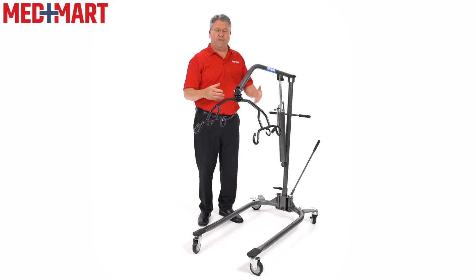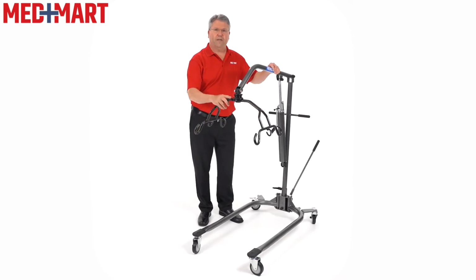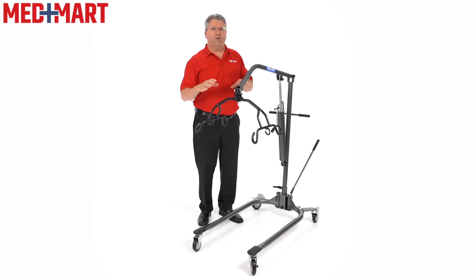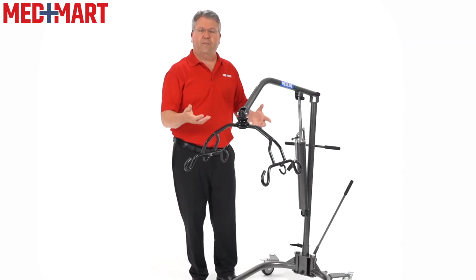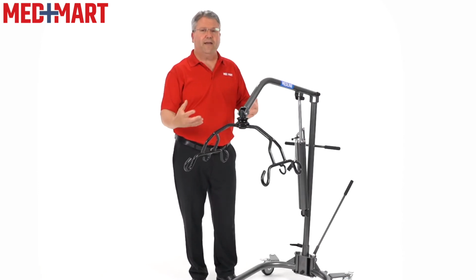Keep in mind, when you're talking about moving a patient lift like this around, it is nice having oversized casters. It does narrow up to kind of make it easy to turn around things. But keep in mind, it makes it easier if you're on tile, wood flooring, linoleum, something like that. If you do have carpet, a couple things to consider. One is the weight of the patient that I'm moving, how thick is the carpet, how thick is the padding. So all that kind of factors in together.